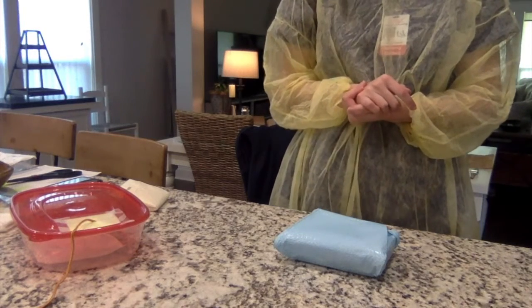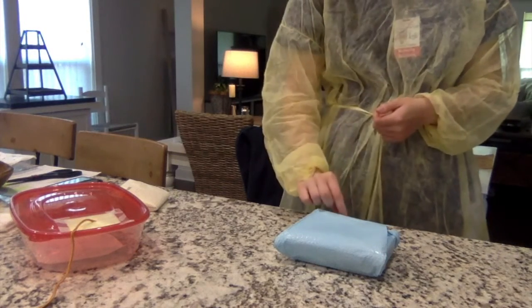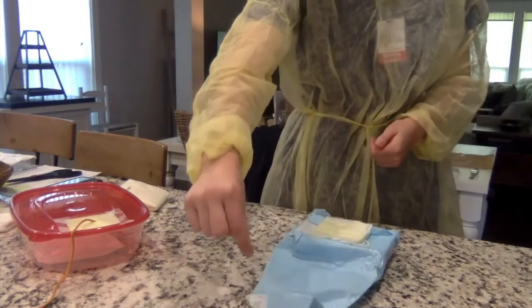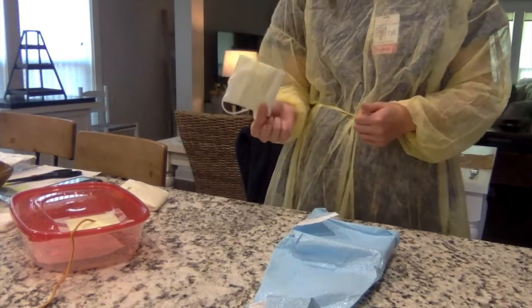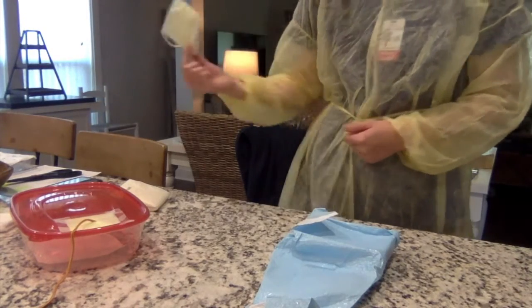Okay, so the first thing I'm going to do is I'm going to open my kit using aseptic technique, maintaining my 1-inch border. So I see here that I have a mask, and normally I would place this onto my patient, but today I'm just going to set it off to the side.